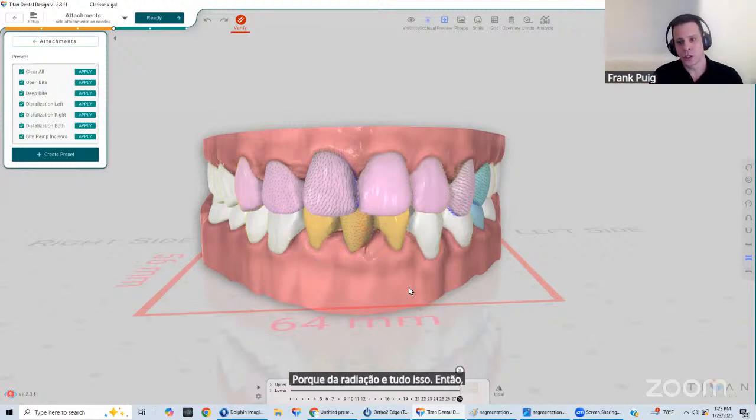So you lose a lot of doctors, a lot of patients, a lot of cases that you are not going to have that information. So we have been working on obtaining that information from the X-rays with pretty nice AI that we have been trying, and it's producing. I mean, it's not the same as the CBCT, but it gets really, really close. So we're going to be announcing information about that and opening that to early access very soon.